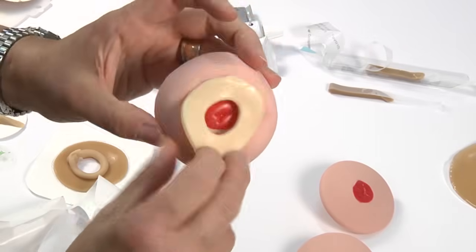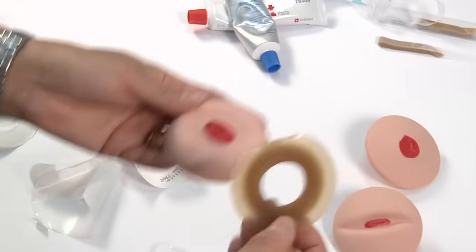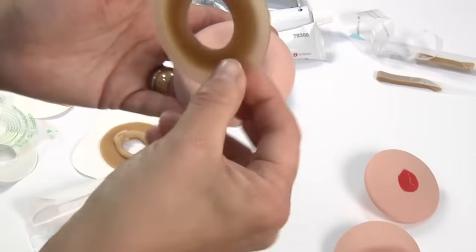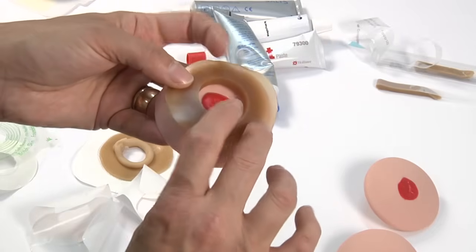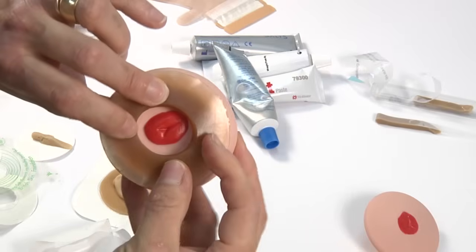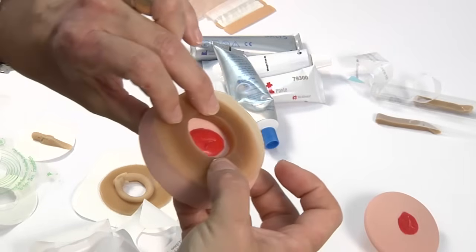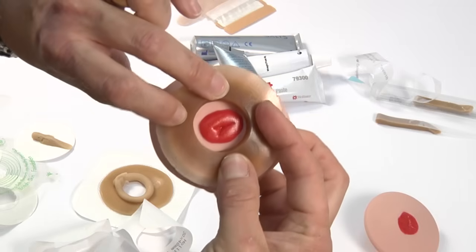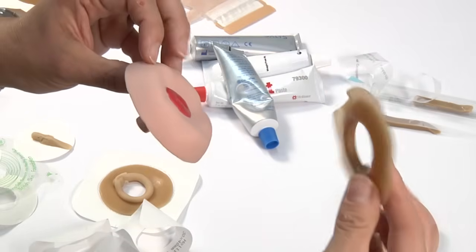So probably that slim is insufficient. But if we were to take this, the convex barrier ring, and fill that into the shape like that before we put our barrier on, you can start to see that you're getting closer. You would need the smaller size, but you could see that you're getting into filling in those dips and gaps a little bit better, so that you would be looking for a deeper convexity.